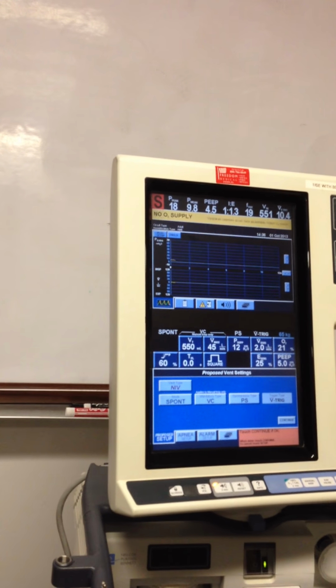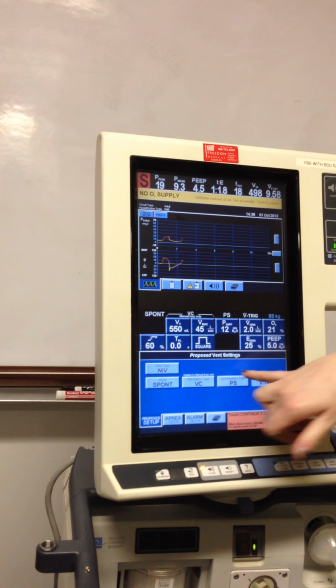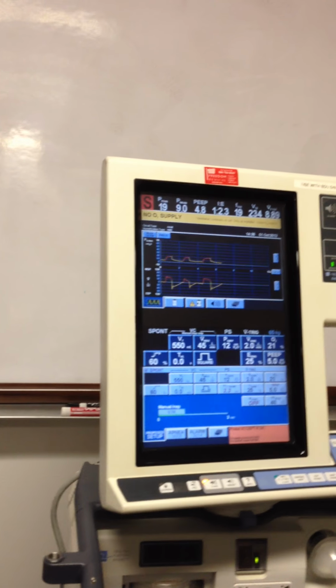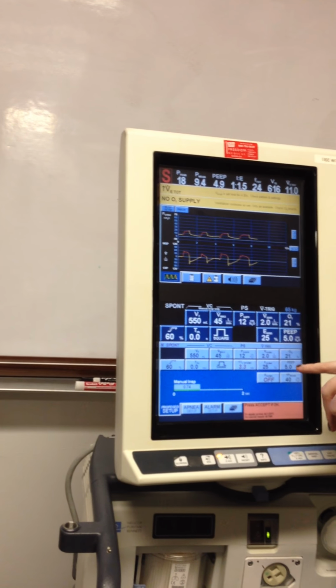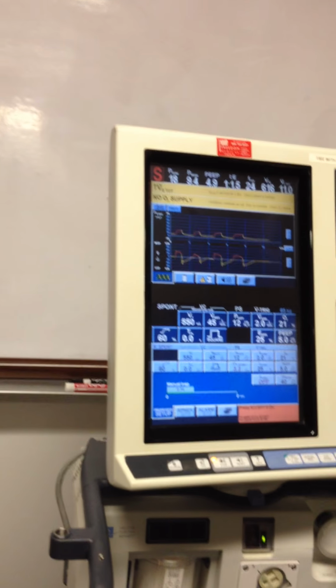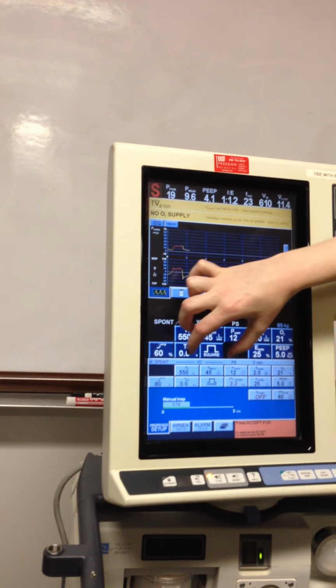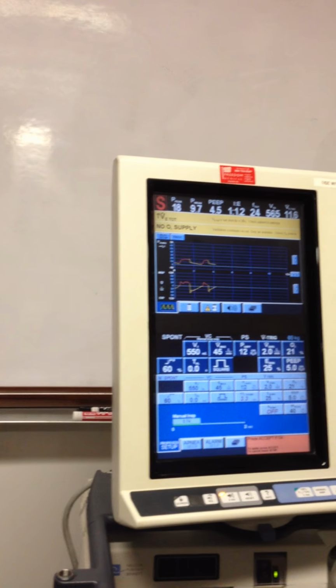This applies to manual inspiration only. Tells you right there, pressure support breaths. Okay, continue. Again, we haven't put them in the NIV. We're going to change whatever. This looks great to me. So these again are only going to be if you give somebody a mandatory breath.